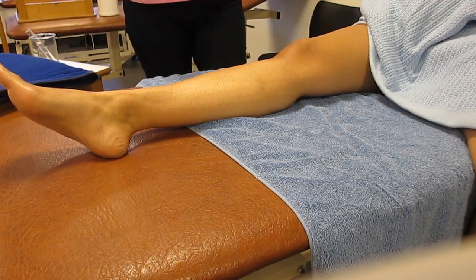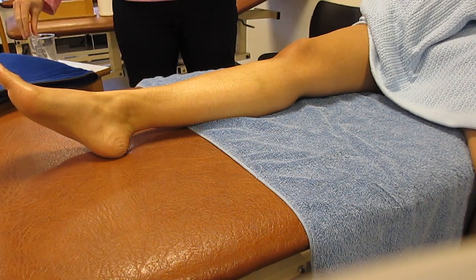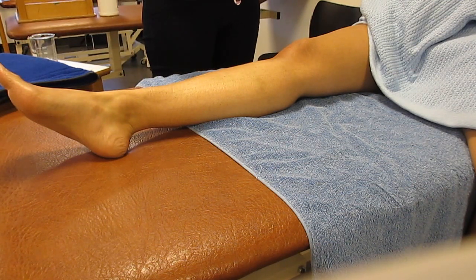Prior to applying the heat pack, I need to check that my patient doesn't have any contraindications and I need to ensure that my patient has good skin sensation. So I've got my two test tubes — I ask my patient to close their eyes and I'm going to ask them to tell me which is hot and which is cold.